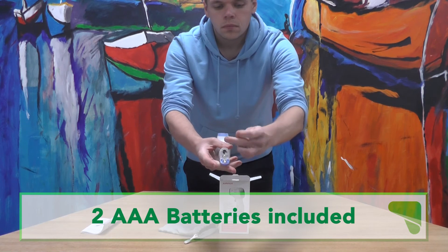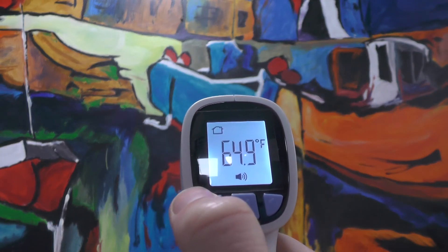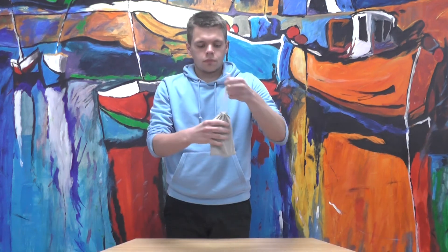Two AAA batteries are included with the thermometer, and it displays temperature in both Celsius and Fahrenheit. A cotton bag is included, so you can easily transport and store the thermometer without risking scratching the unit.